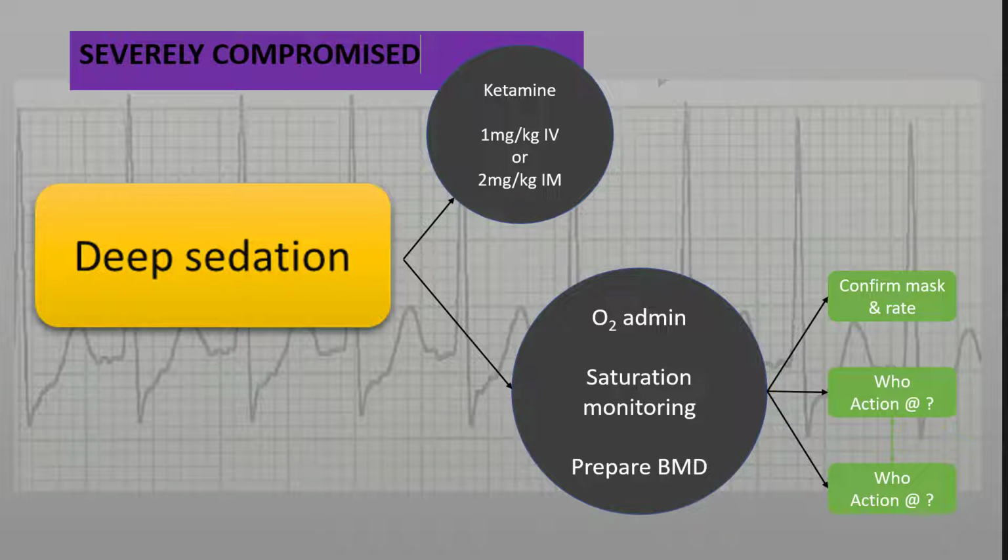Electrical cardioversion normally involves the delivery of 360 joules of energy, and hence is an unpleasant and very painful experience. So, having established cardioversion as the appropriate treatment, the remaining distinguishing feature paramedics need to establish is whether the patient is going to require sedation prior to the cardioversion. The line in the sand is whether a patient can obey a command or not.